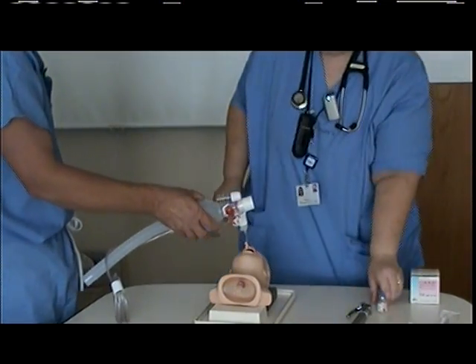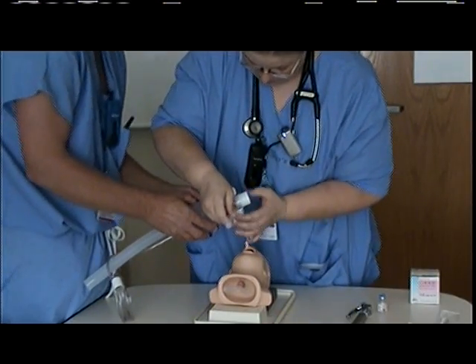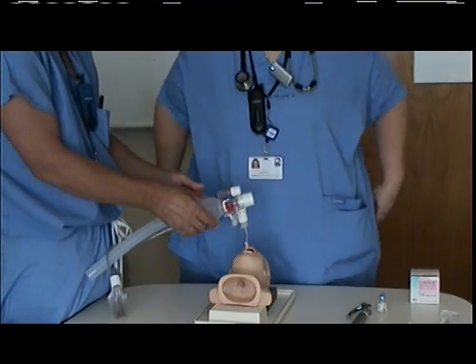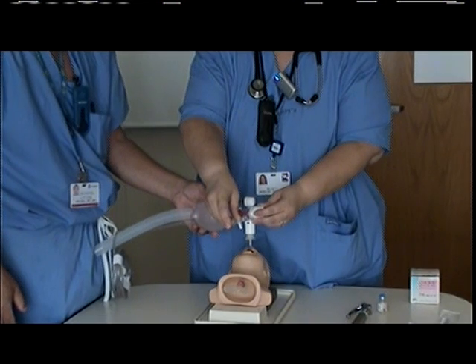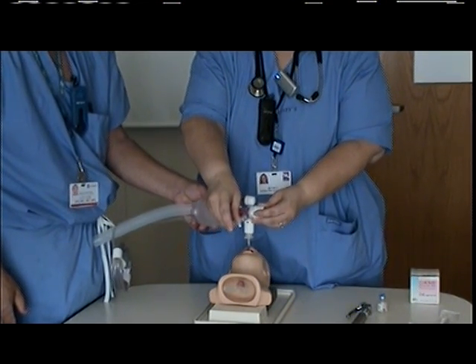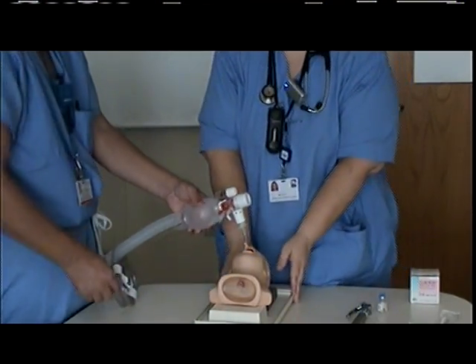Once the ET tube is secure, you're going to attach your vial of CuroSurf to the administration port on the AMBU bag. You're going to administer half of the dose of CuroSurf while the infant is in the supine position, continuing to ventilate until the surfactant is no longer visible in the ET tube.